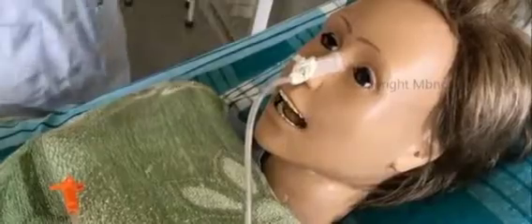Now sometimes the tube will be long, so again we cover it and fix it on the forehead. Again we cut the tape and fix it on the forehead. If the remaining part is more, we fold it and keep it in the patient's pocket.